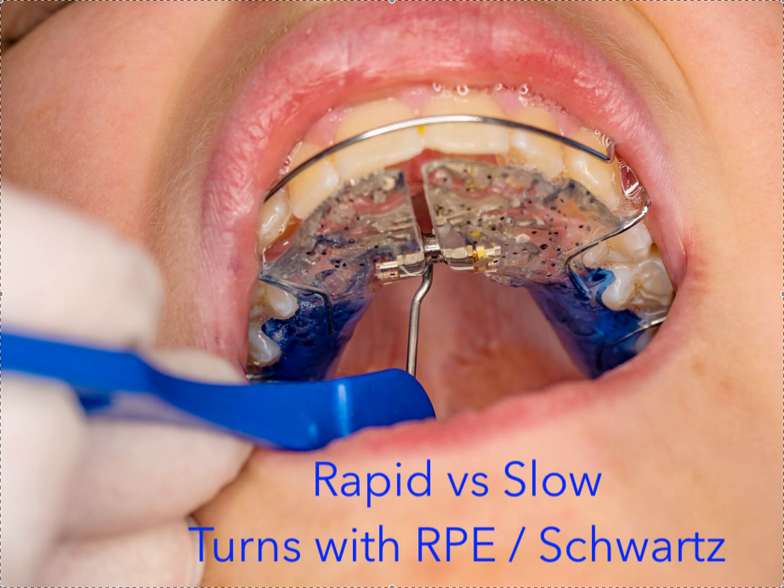Today we're going to talk a little bit more about turn frequency in expanders, be it a fixed RPE, a Hyrax, a Schwartz, whatever type of palatal expander you want to use. And maxillary, mandibular, whatever. Mandibular, of course, is not a palatal expander. It's just an expansion device because there's no suture. But we're not going to get into the weeds too much with all that.